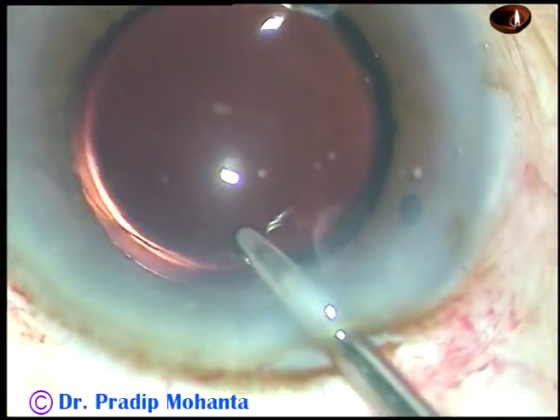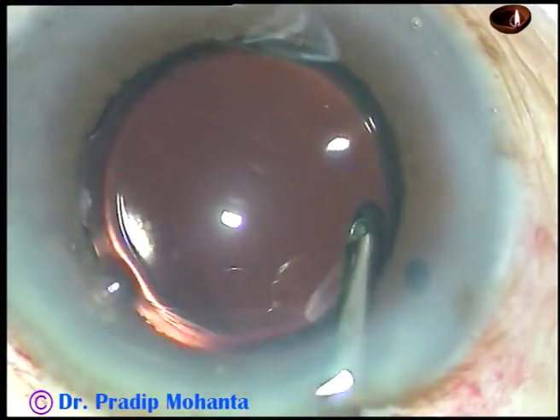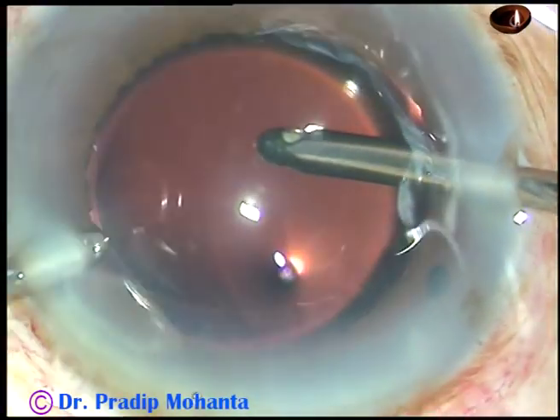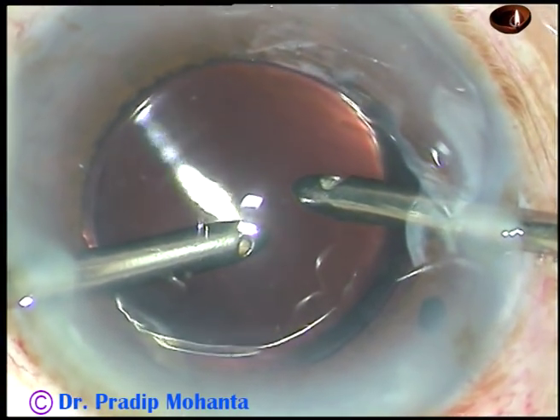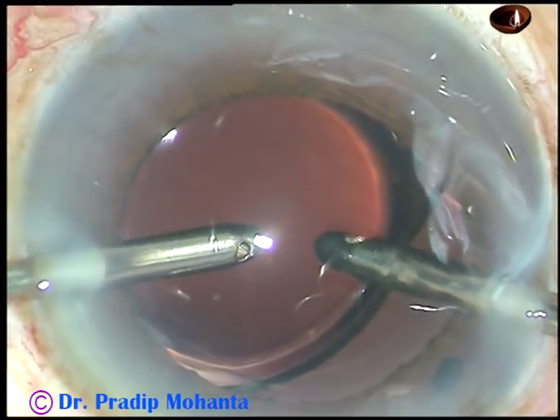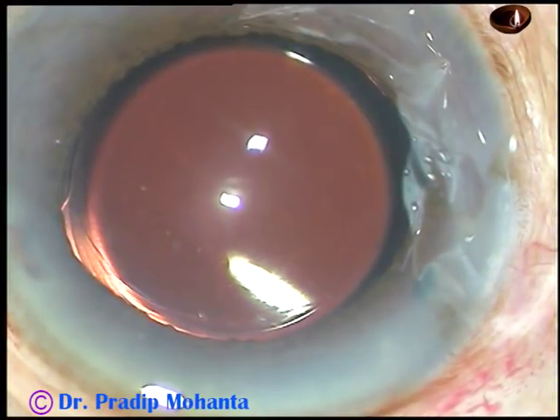The lens is oriented in such a way that the haptics are about 90 degrees away from the main incision. Now, thorough cleaning of the viscoelastic substance is essential. I irrigate the anterior chamber, and now I use irrigation and aspiration together. I put the irrigation behind the lens in the capsular bag and aspirate. In this way, thorough cleaning of the viscoelastic substance is done.